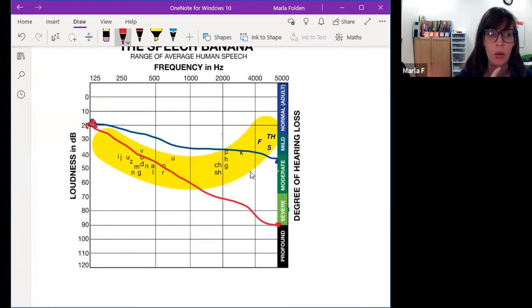That's one where the ears don't match. If you're thinking about this, that means they hear better in the left ear. I'm going to present my instructions to their left ear where they're going to hear better. They're not hearing everything, but they're at least hearing this k, b, p, h, g, these kind of sounds in the middle here, which their right ear can't catch.